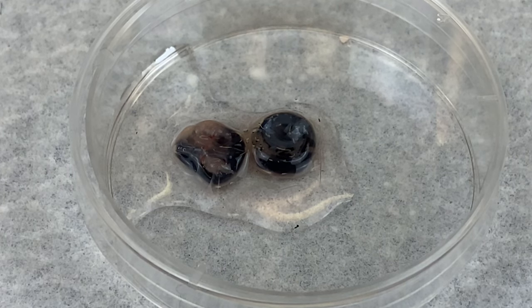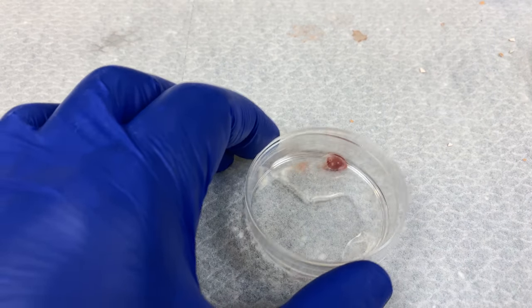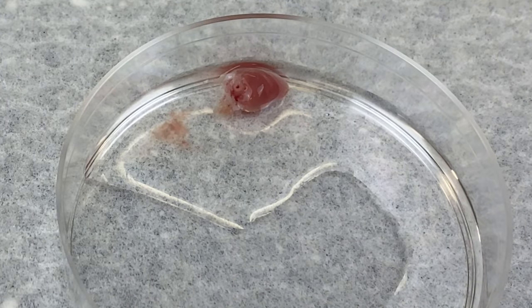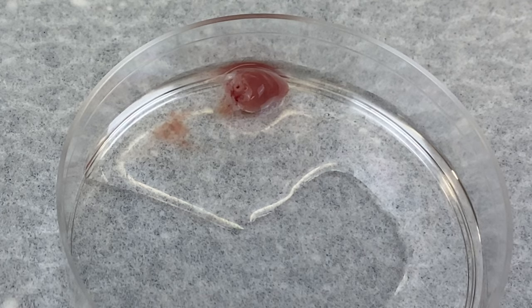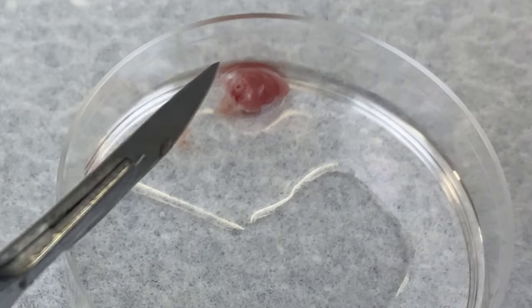We removed the viscous fluid inside, and we'll just be culturing the black part. For the remainder of this video, I'll be disaggregating the heart. To start with, we'll sterilize our forceps and our scalpel blade, and we will cut the heart up into very small pieces. Did you see that again? It just beat.